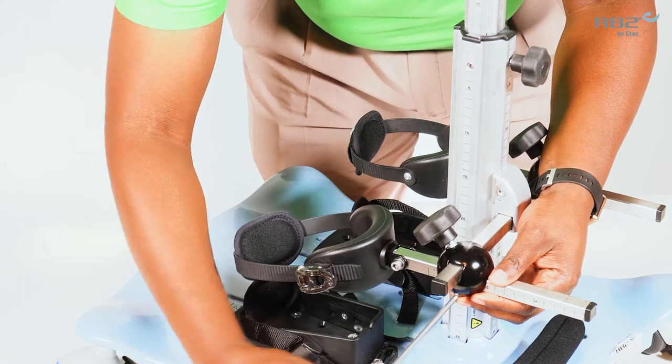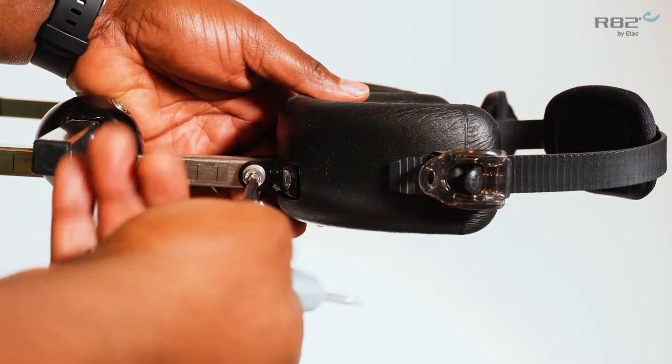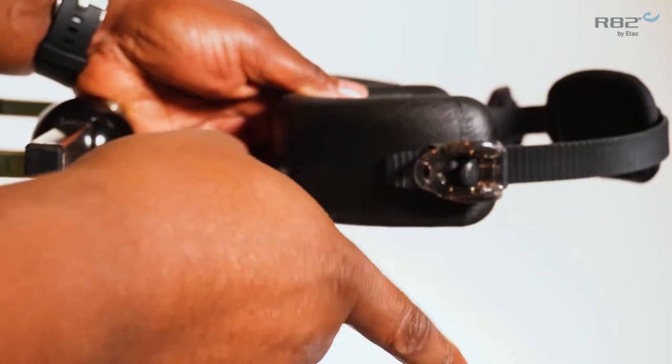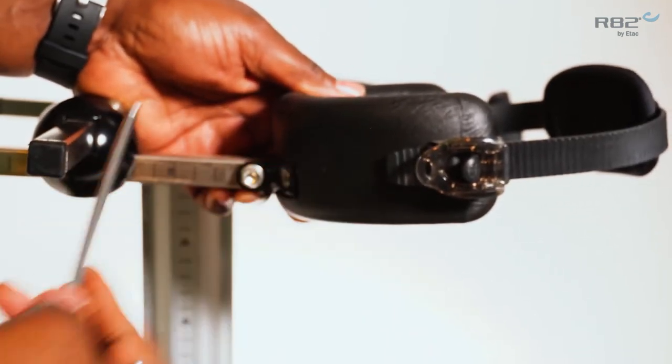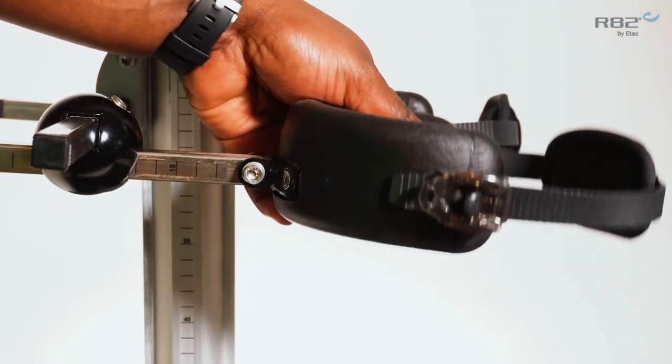The knee support also has an angle adjustable feature. By loosening the 5 mm bolt foot adjustment located at the front of the knee cup, you're able to adjust the angle of the knee support.